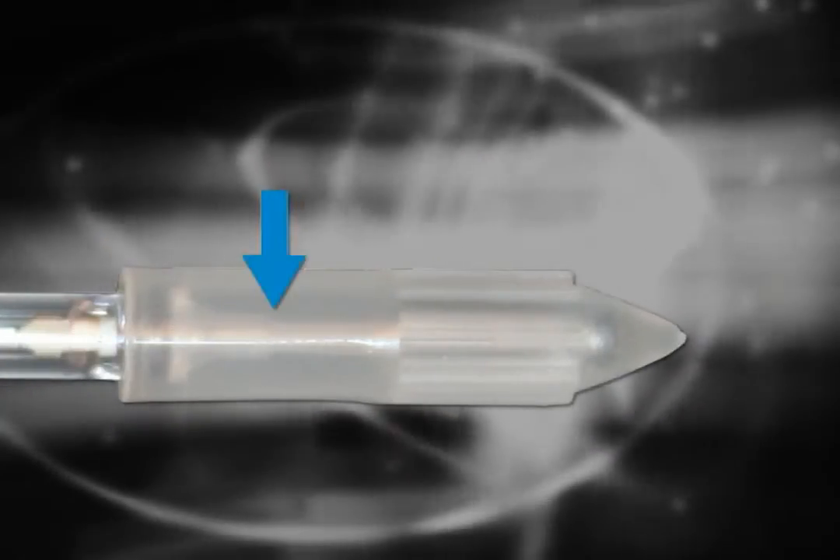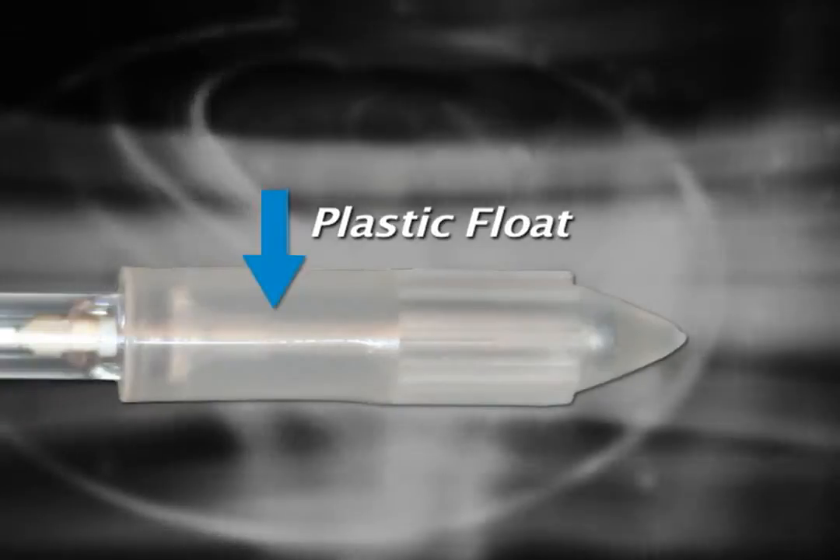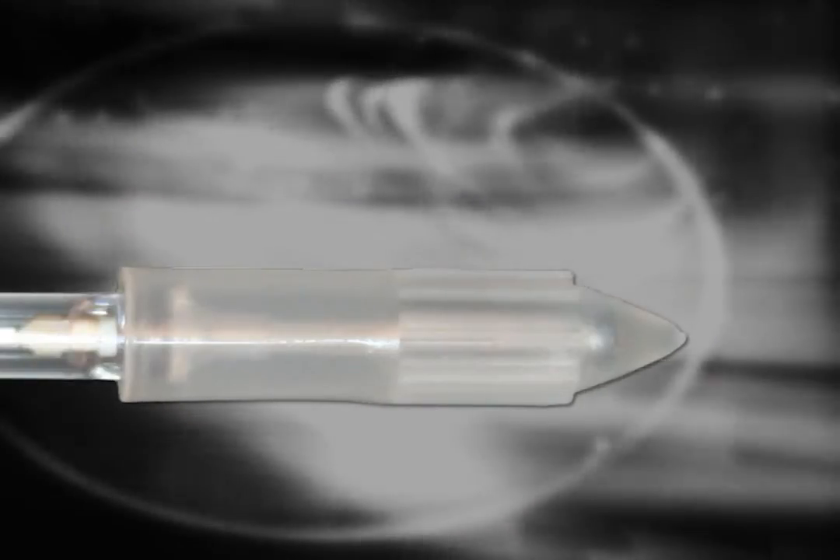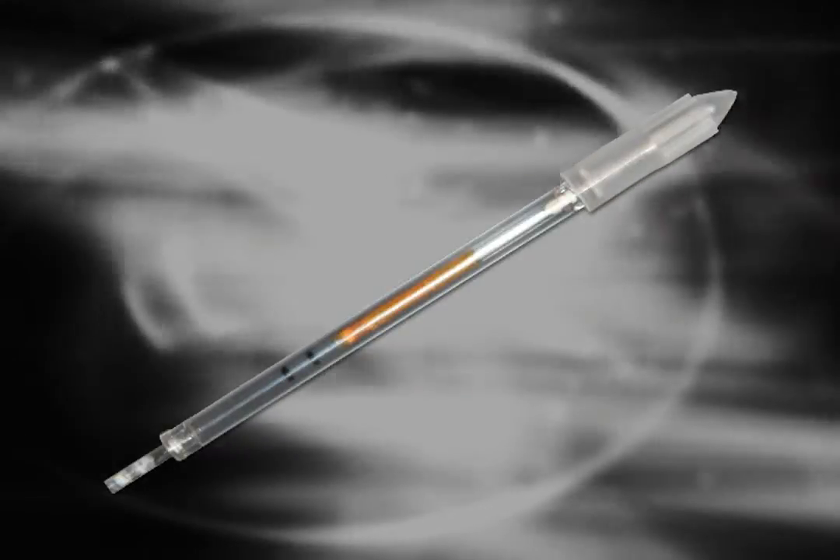Inside the cap is a plastic float, which descends into the tube during centrifugation. This float expands the buffy coat layers and is instrumental in calculating the hemoglobin level.